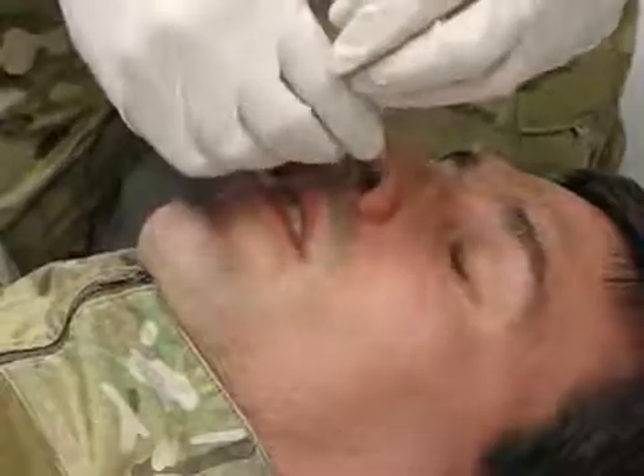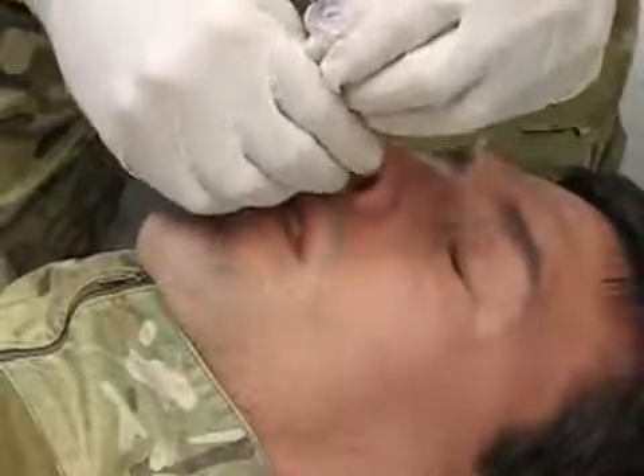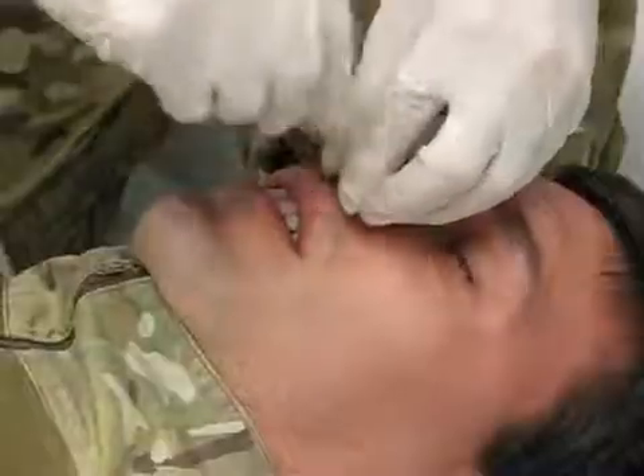If resistance is met, it may be necessary to gently rotate the NPA. If the casualty still does not accept, attempt the other nostril. The NPA should be inserted until the flange is touching the nose.